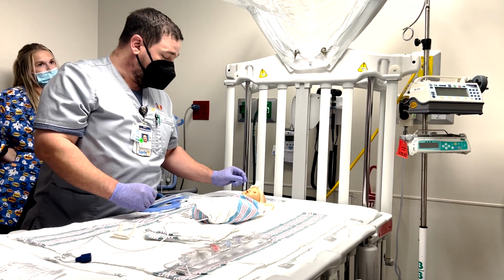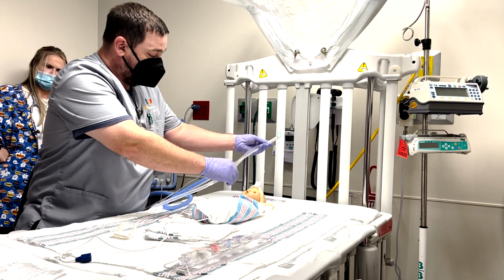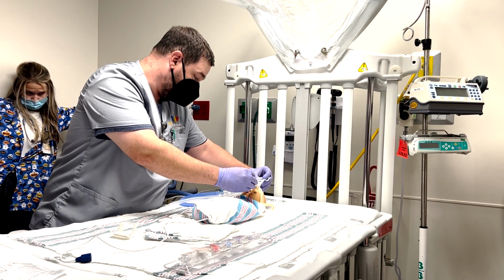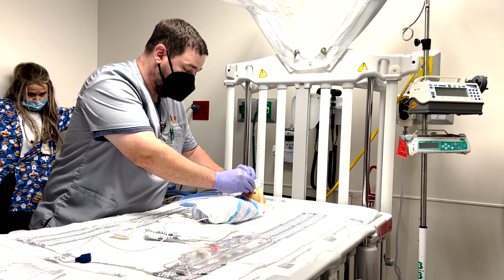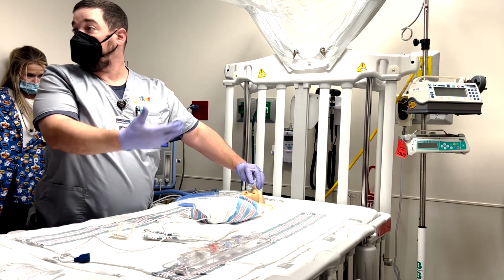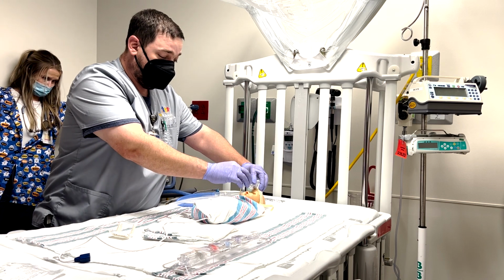So back to why this piece is important. When you put this on the baby, the small one goes first, and the large one there. You set that down over the child's nose. Now, when I do this, it'll create a seal and it'll stop doing what it's doing right now, but that's because this baby does not have fake lungs. Take this piece here.